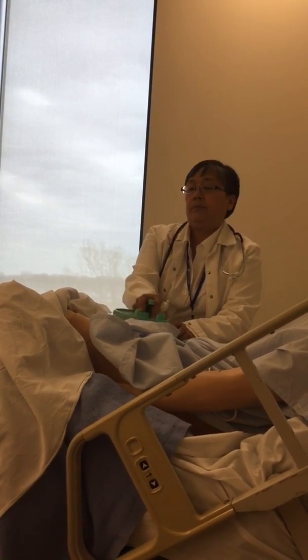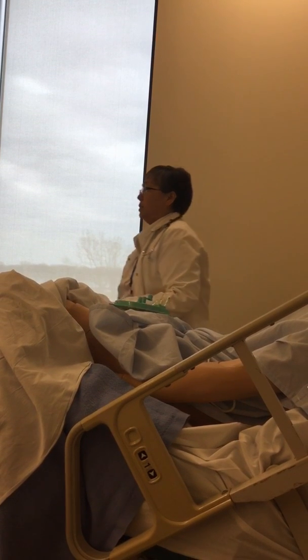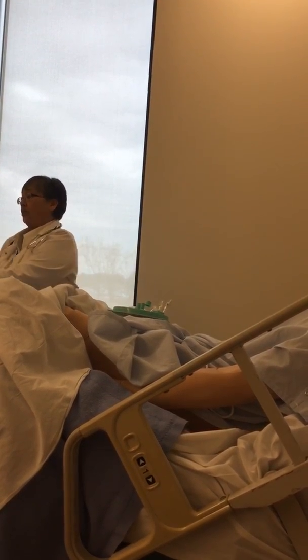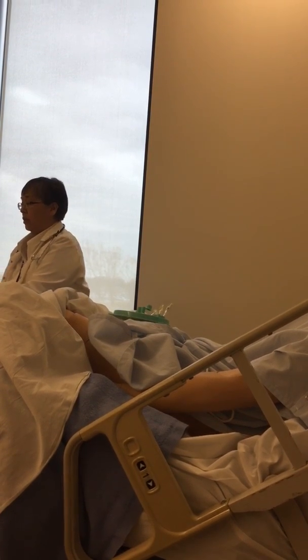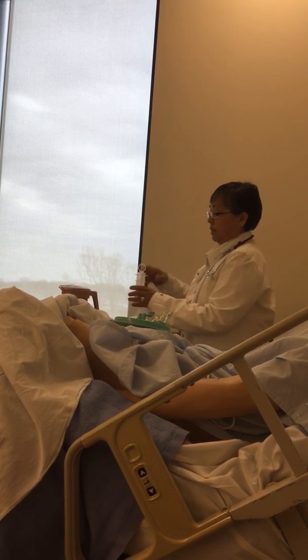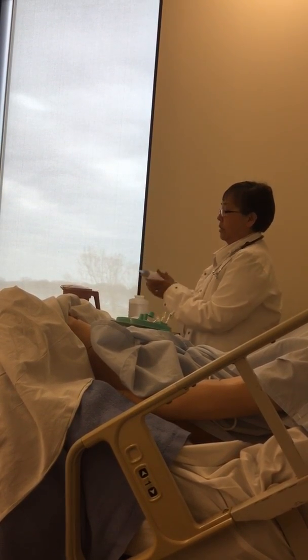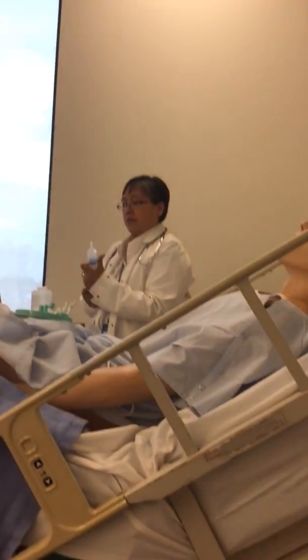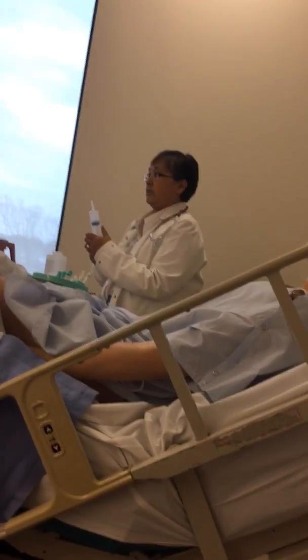Okay? So it says in the textbook, before you actually give the medications, you're supposed to check for placement. So bring your whole table close to you. I'm going to take 15 cc, I think it's 30 cc's of air, right? 30 cc's of air.